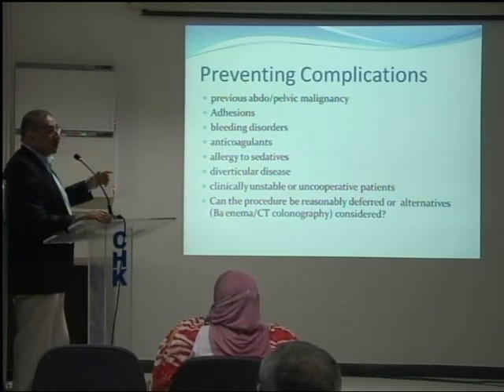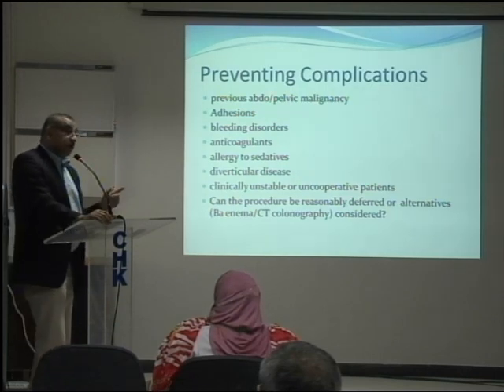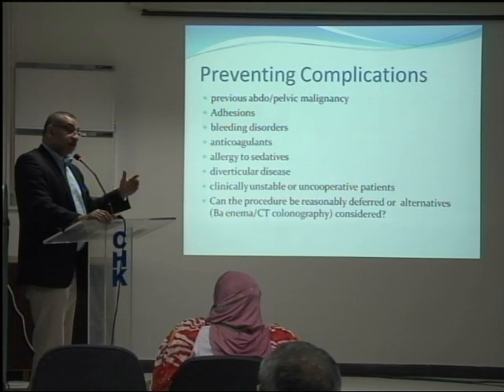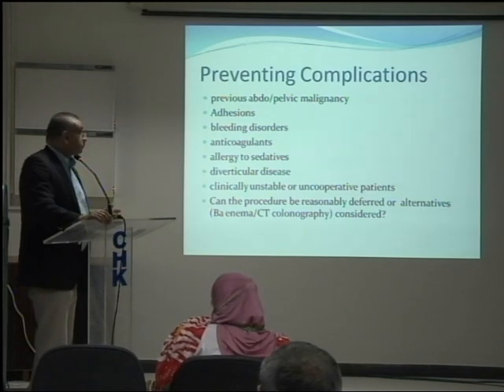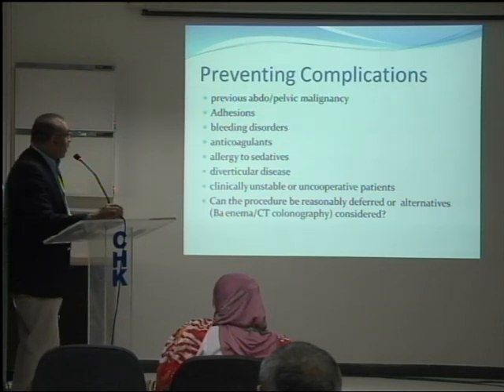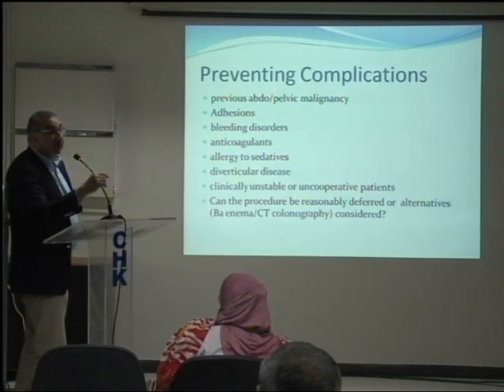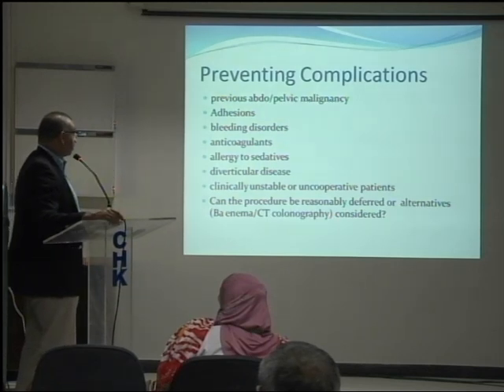Bleeding disorders: normally if a patient has a bleeding disorder, we consult our hematologist. They can give factor 8 or whatever, so they usually give advice. The other problem is people who have conditions like von Willebrand disease or hemophilia are also at risk of CJD, variant CJD. So for those patients, if you carry out any therapeutic procedure or biopsy through your biopsy channel, that can infect your scope and potentially infect other patients. So beware with hematological disorders.